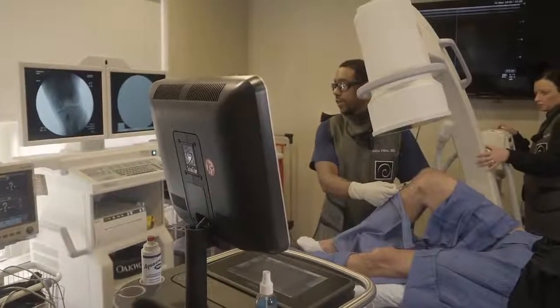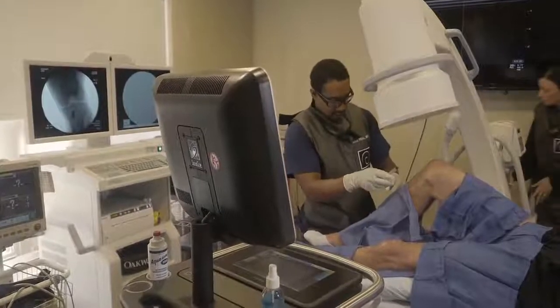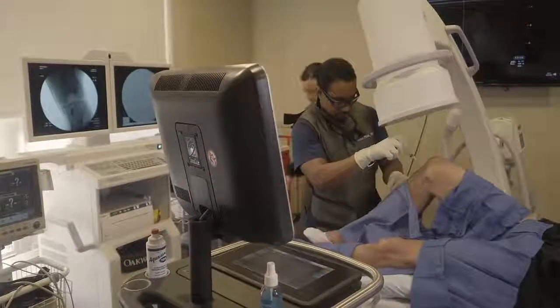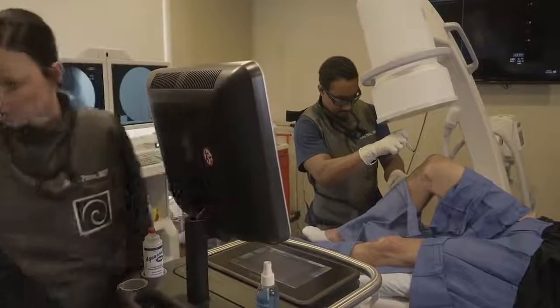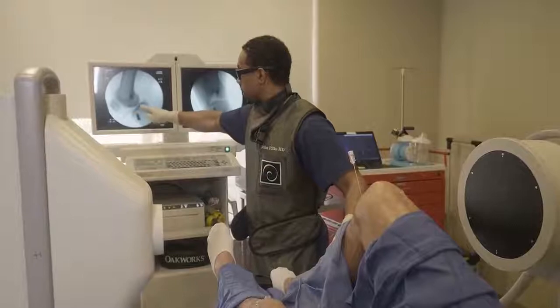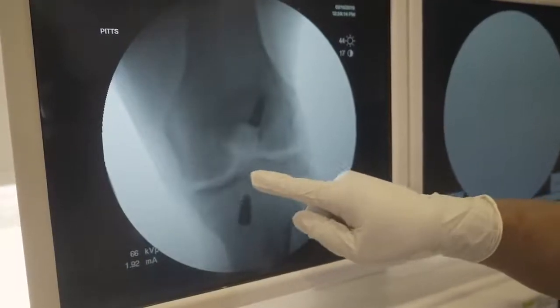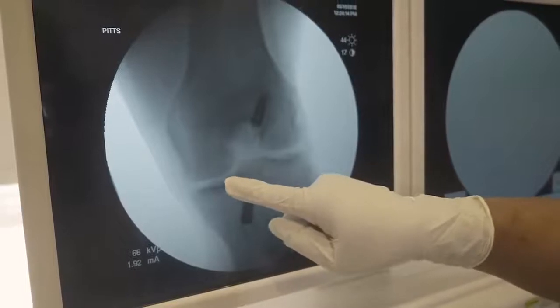Now we're using fluoroscopy to guide this injection directly on top of the meniscus. This approach will cause a little less tissue trauma and get it directly into the joint where he has the problem. We're going to numb up first, then guide our needle onto this area — the medial joint space where the medial meniscus will lie. This is where we're guiding our needle.